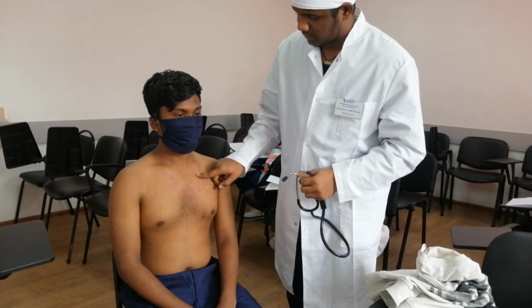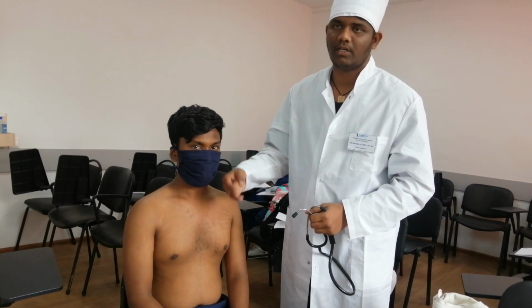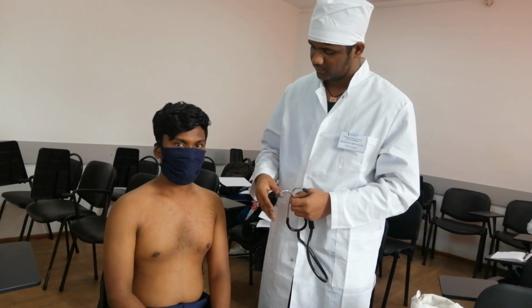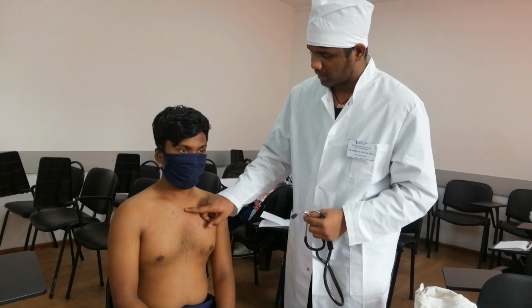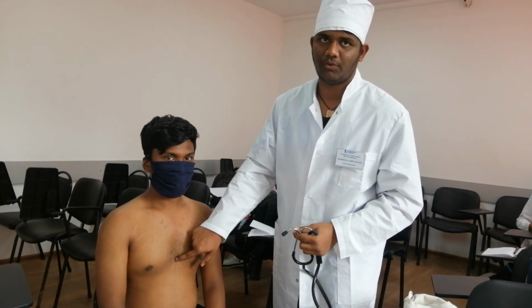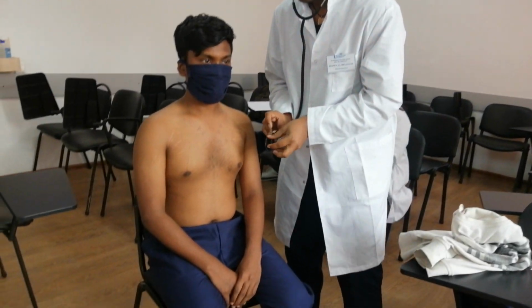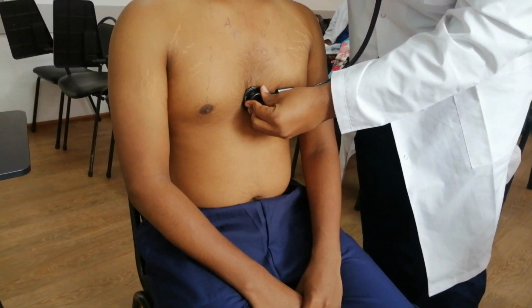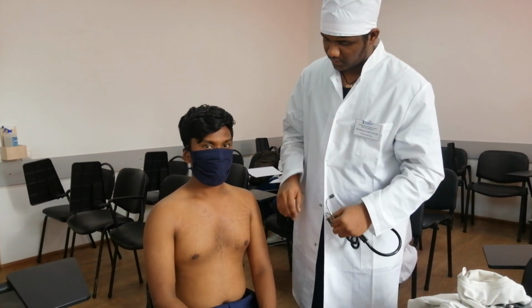Next point name: we have the tricuspid valve point. Fourth point, tricuspid valve point, where? The tricuspid valve we have at the sternum, towards the xiphoid process, under the xiphoid process. Okay. Listen. Are you listening to the sound? Yes, ma'am.